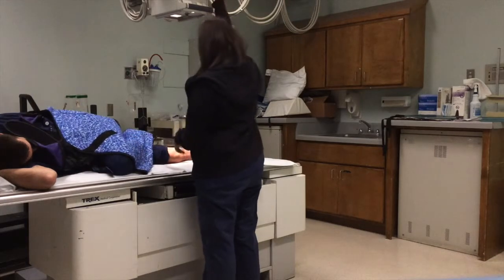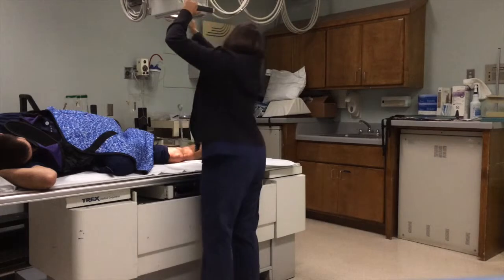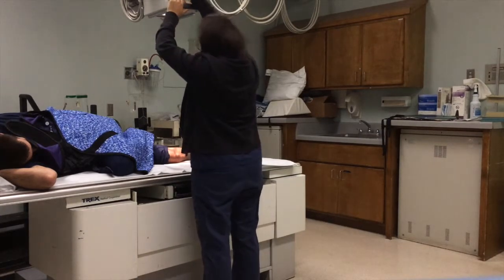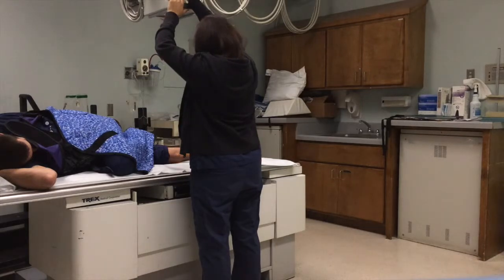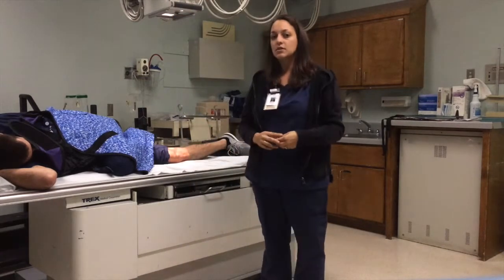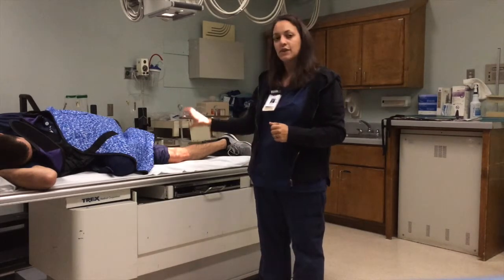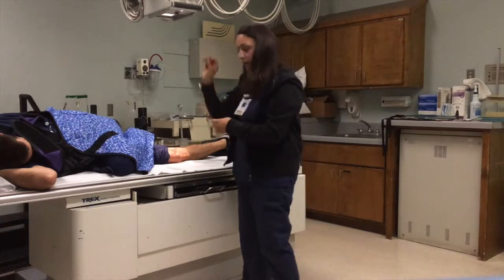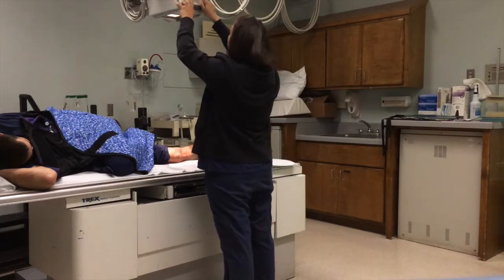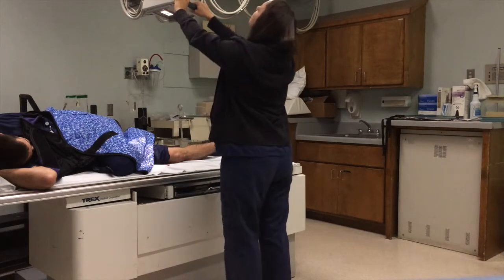So there's his knee. And a little below, a little above. I am going to increase my technique to about 70 at 5 because I increased my thickness. And here's my right marker. Before I get started, actually, I'm going to 5 to 7, which is this here.